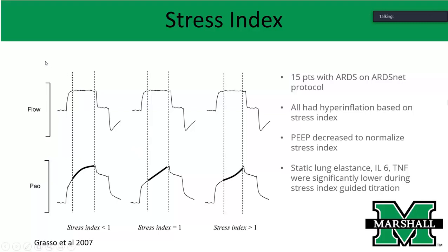Okay? So we have to change the flow to a square waveform, and you can do that on the vents. I do it transiently when I'm looking at it. This is the airway pressure scalar, right? And you can tell here, for example, that as gas fills the lung, pressure goes up, okay?